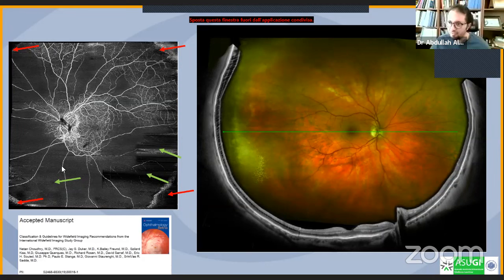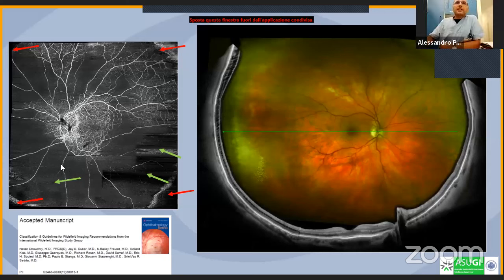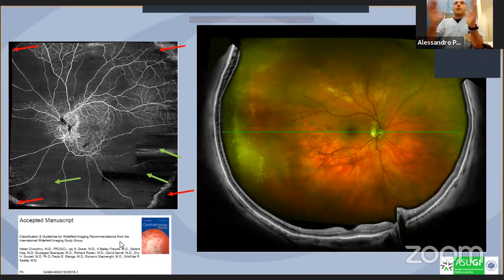And this is for clarification, Alex. This is only a swept source can do that, isn't it? So this is with the spectral domain in this case. But the spectral domain, as we can see here, this is the widest scan that you can have with this instrument. And in order to have such a wide scan, you need to decrease the resolution, as we see in the previous case.